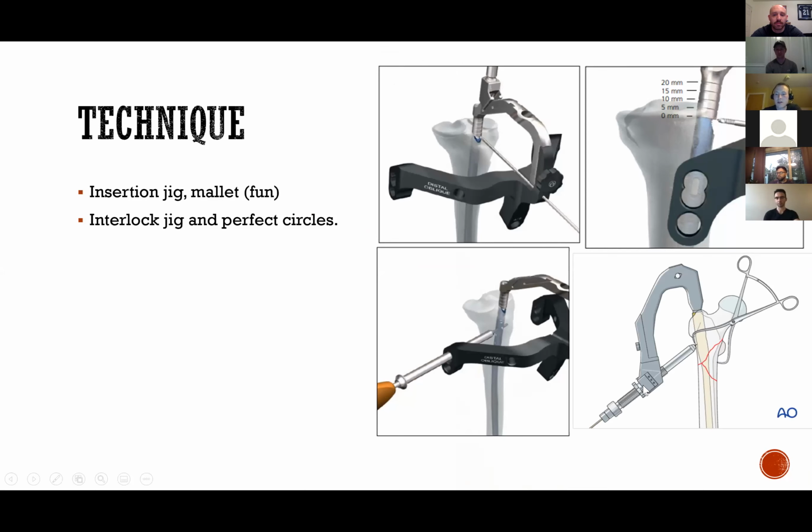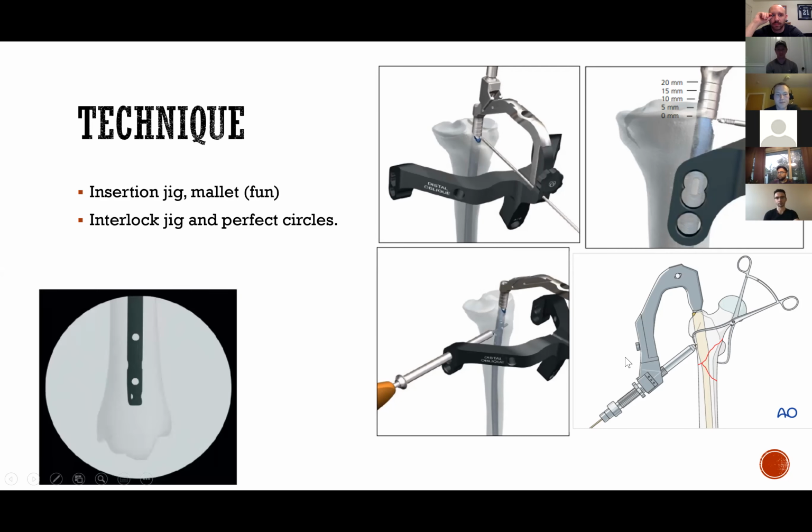Here's a jig looking at a femoral nail. This would be for a cephalomedullary type device to fix the head of the femur. In order to put bolts in the distal part of the nail, you have to first start off by getting a perfect radiograph that's looking straight through the distal interlock hole.